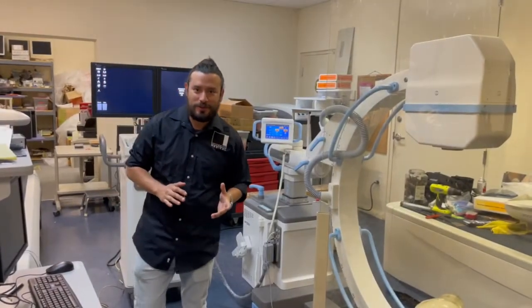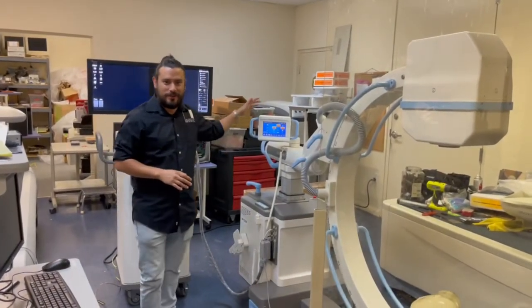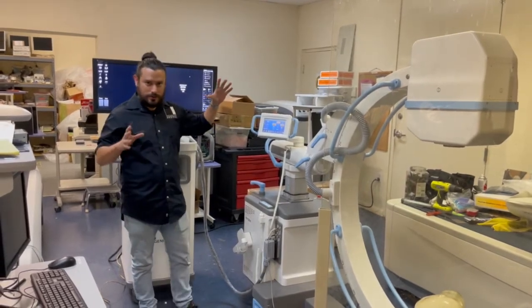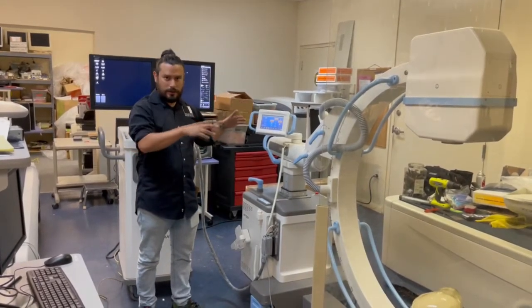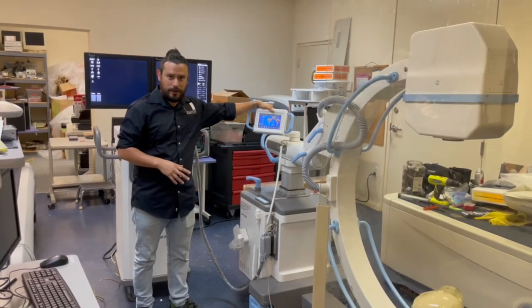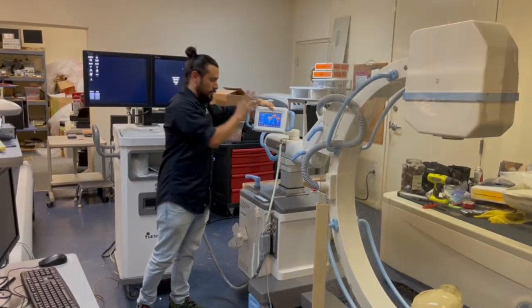Here in Taylor 2 Medical, we have a new C-Arm that just came in — it's a Gina Ray Zen 7000. We're going to take a few shots, show you around, and how to manipulate it. A very nice feature: it has an extra display, and actually everything is controlled from this display. Come take a look.